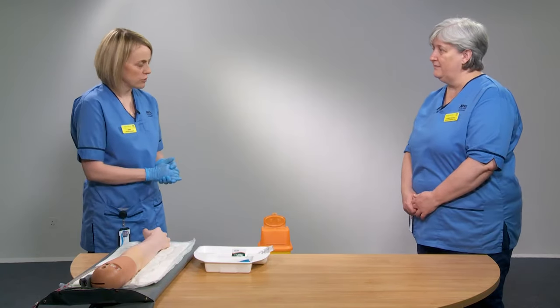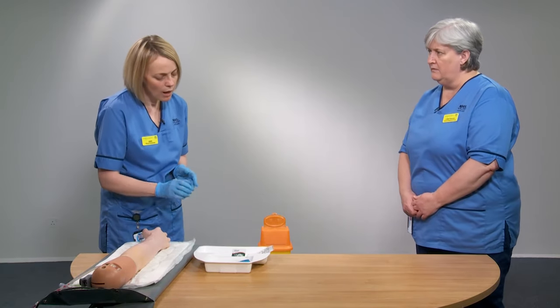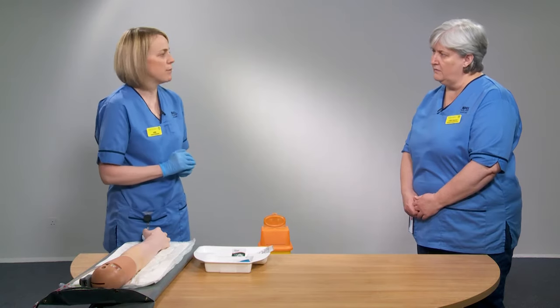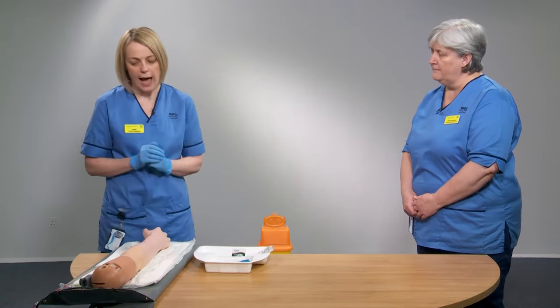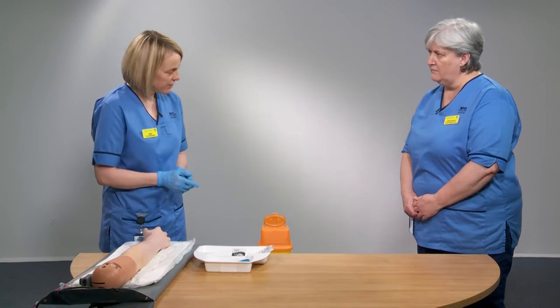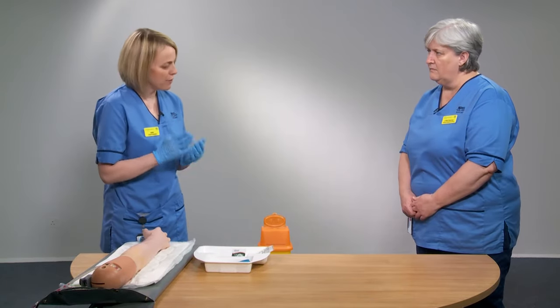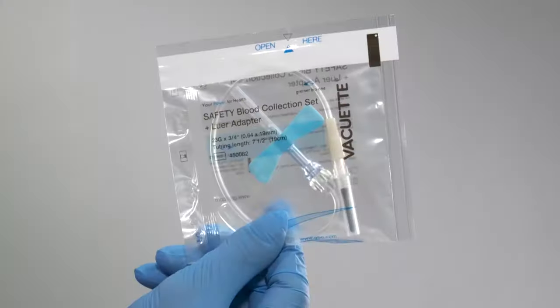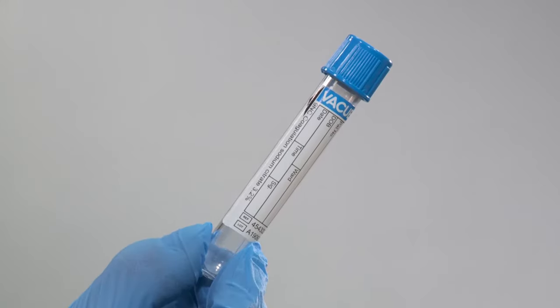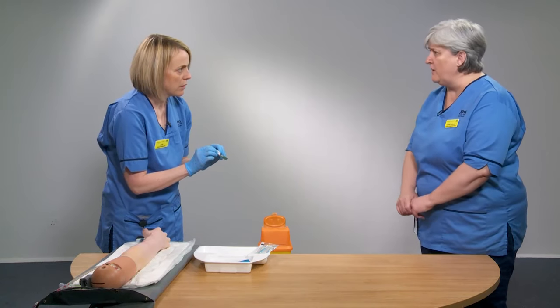Next, we'll look at the equipment, which you gather together on a clean white tray. Today we'll show two different venipuncture devices used within our organisation: the butterfly needle and the quick shield. For the butterfly needle, you'll need the butterfly needle itself, the vacuette container, blood bottles, and something to clean the skin.